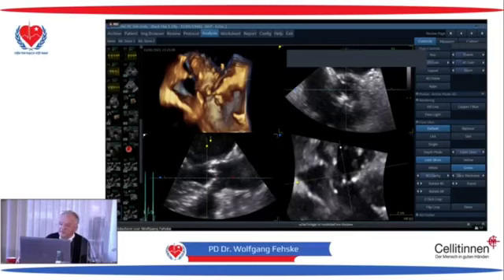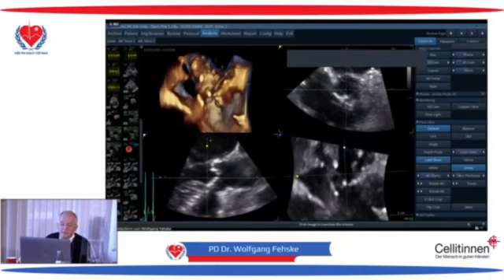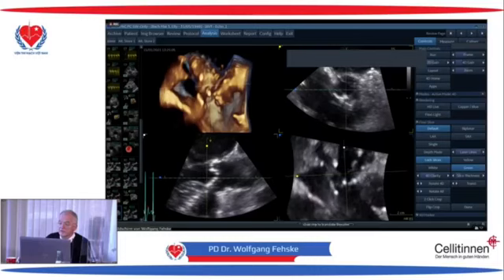It is really bended. So we must do it like that and put it a little bit higher. You see the problem where I am. Yeah? So this is the annulus.